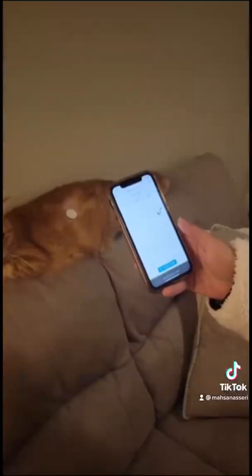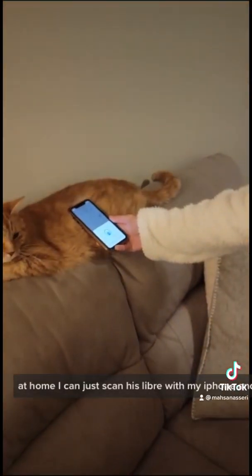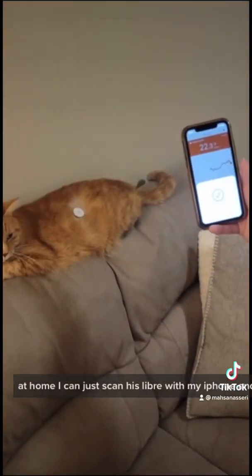Then in one hour, the Libre will be ready to start reading. At home, I can just scan his Libre with my iPhone, and that will let me know his glucose levels.